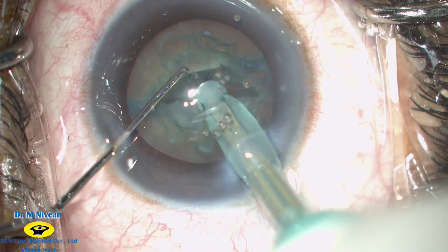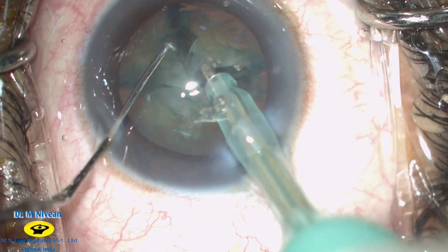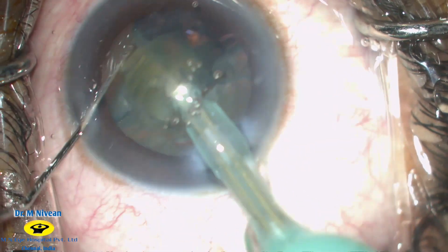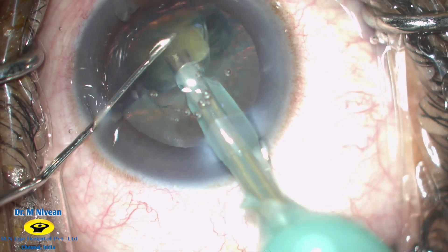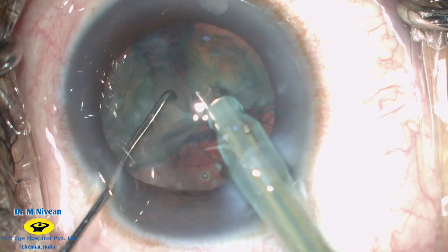In phaco 2 mode, the probe is then buried into the core of the nucleus, lifted up, and the chop is then initiated. High vacuum and low power is sufficient to emulsify these NS2 grade cataracts. The same thing is then repeated on the other half of the nucleus as well.